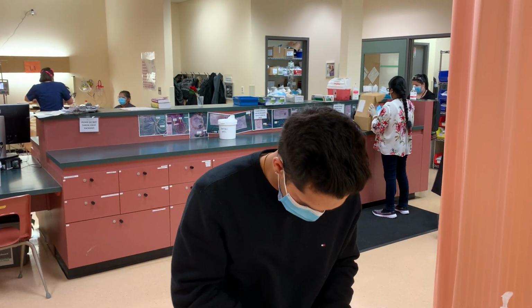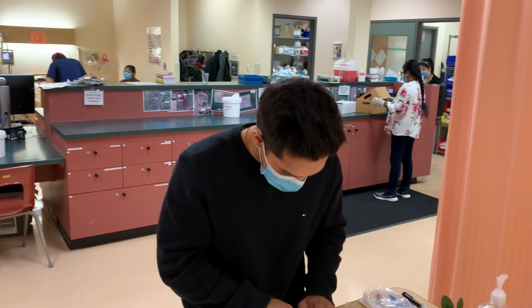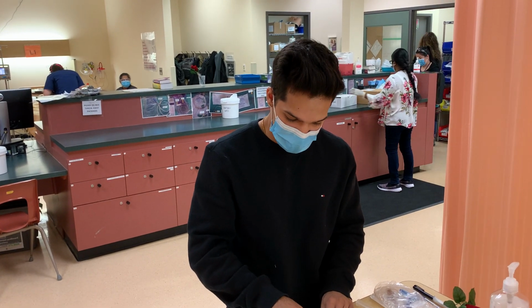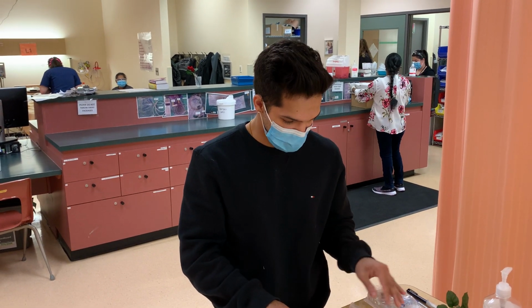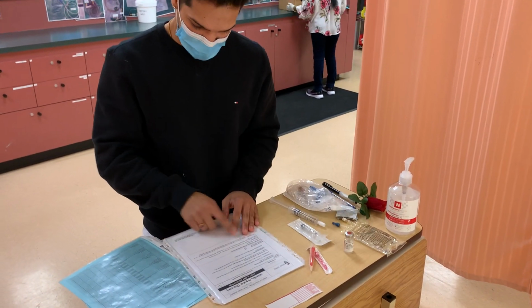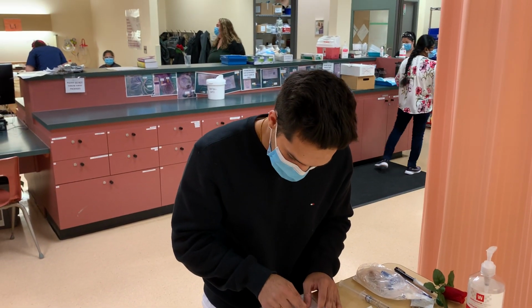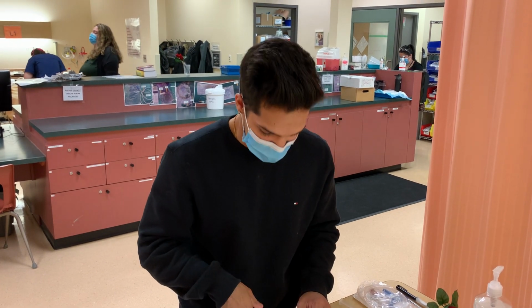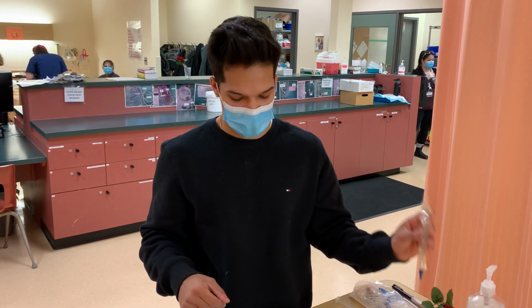And then also insulin continuous. So for the recipe for the insulin IV continuous, I'm going to have to add 100 units using a 3 ml syringe, which I have over here, from my insulin vial, at 100 units per ml. So I'll be drawing up 1 ml, which is equivalent to 100 units, and then adding that to a 100 ml bag of normal saline, which I have right here.